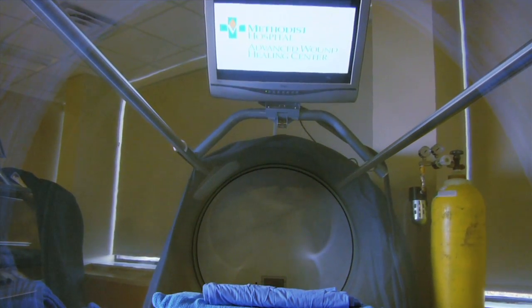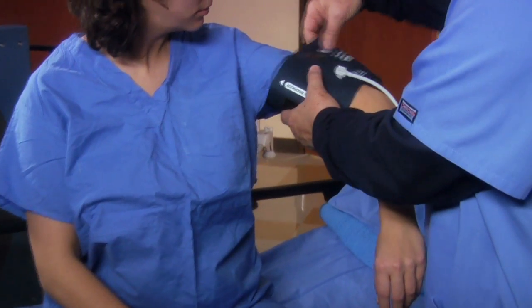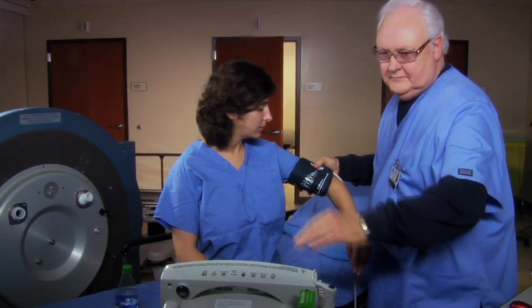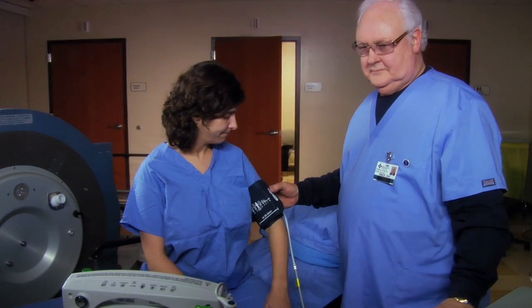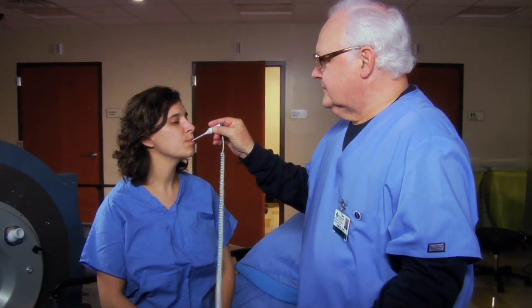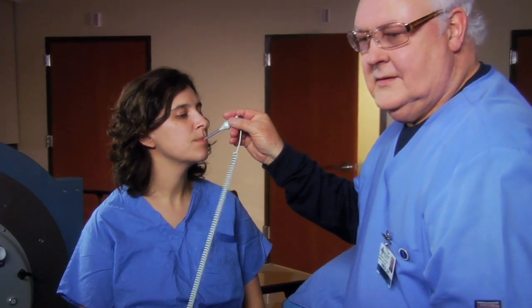Normally what would happen is I would have a doctor's order. Then in addition to that, I would have an orientation time for the patient where I would go over the steps that they need to take, which would be putting on our garments similar to what I'm wearing, scrubs or a gown, hospital gowns. Before they would go into the chamber, we'd take their vitals. In the event that they're a diabetic person, we would take their blood sugar and the doctor would see them. And then we would put them into the chamber and do a hyperbaric treatment.